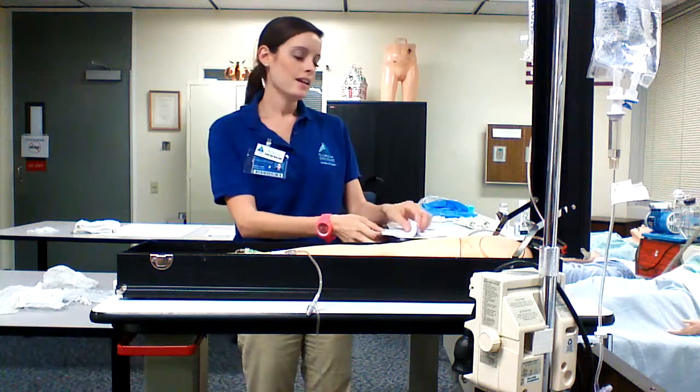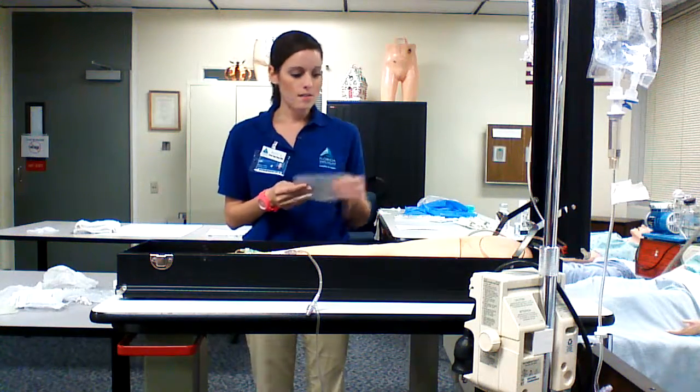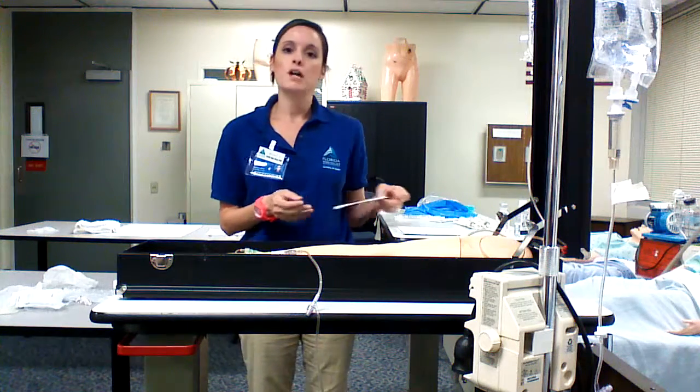Hi, Mrs. Jones. I have your physician's orders. He's ordered for you to have vancomycin administered for the infection that you have. Vancomycin is an anti-infective, and it's used to treat potentially life-threatening infections when other anti-infectives are contraindicated. I am going to administer this medication via piggyback, and there is a primary IV infusing.